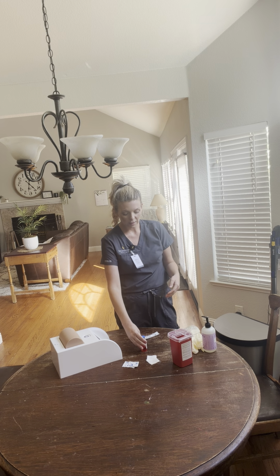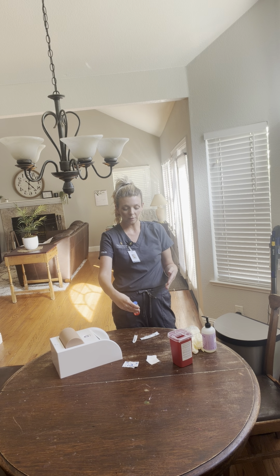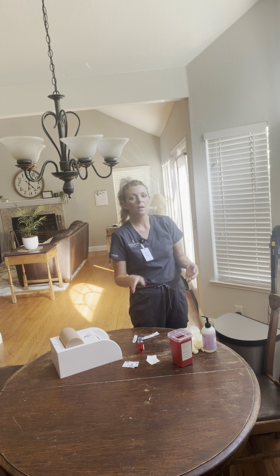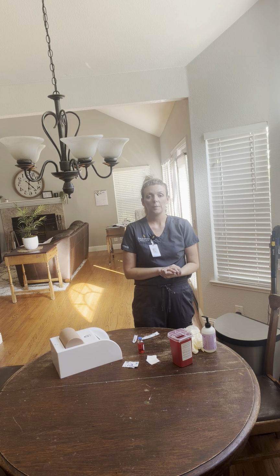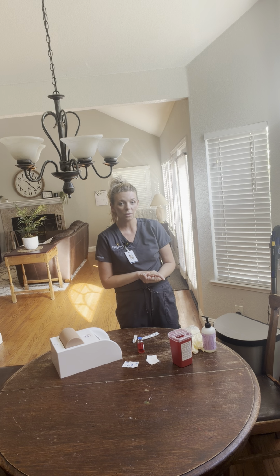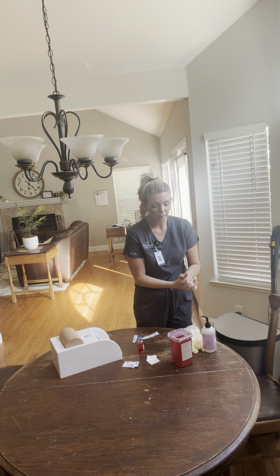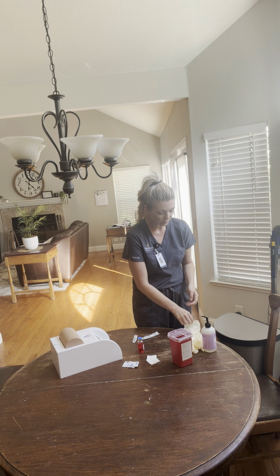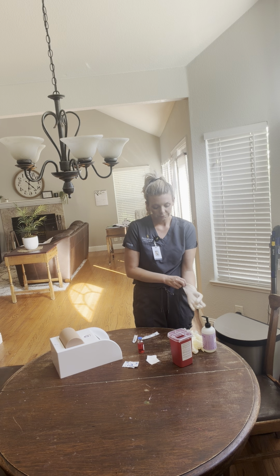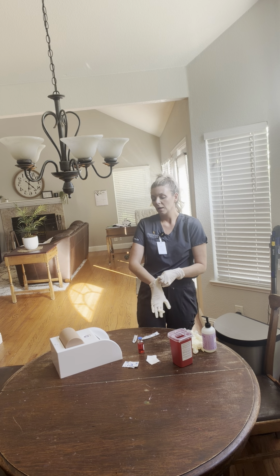What I'm given today is 4 milligrams per mL, and I've done my calculations, and that came out to 1.5 milliliters of morphine sulfate. So I'm going to perform my hand hygiene and place my gloves on. I'm going to educate my patient.